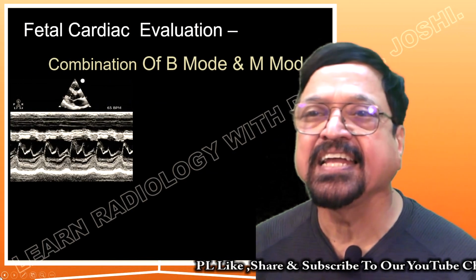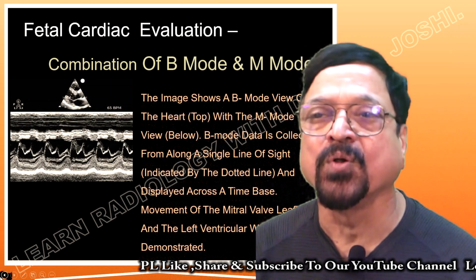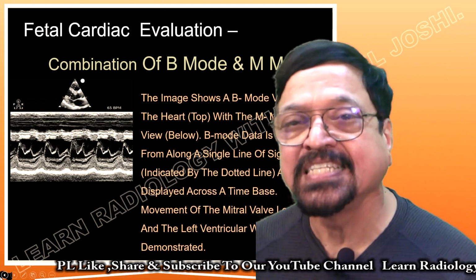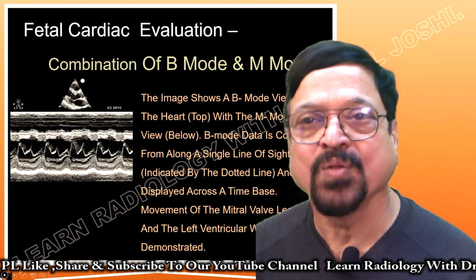Now this is a cardiac echo which uses a combination of B mode and M mode. Please remember this because we are going to see M mode also, and in that we are going to see the M mode application, but this combination image is given only in this.